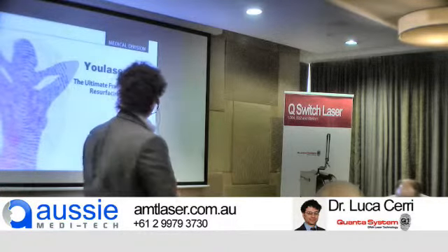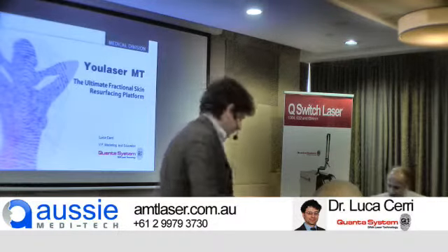device that has been designed for fractional skin resurfacing and dermatology surgery, and has very specific and very new technologies on board. The way that this device is treating the skin is absolutely unique, and I would like to try to explain it to you as well as possible.